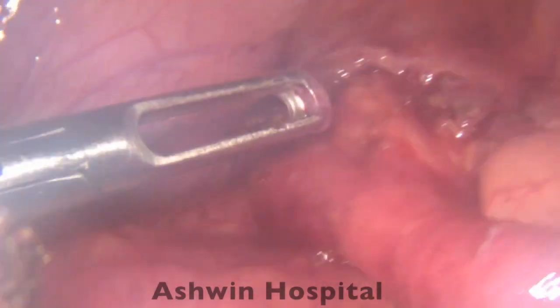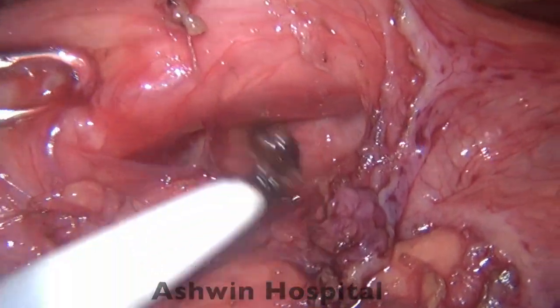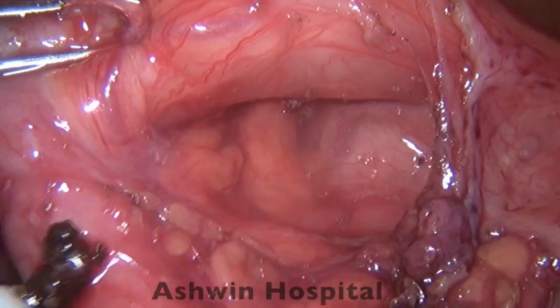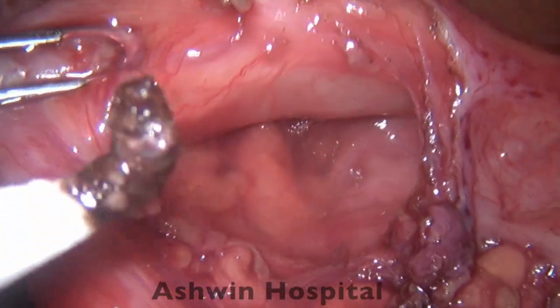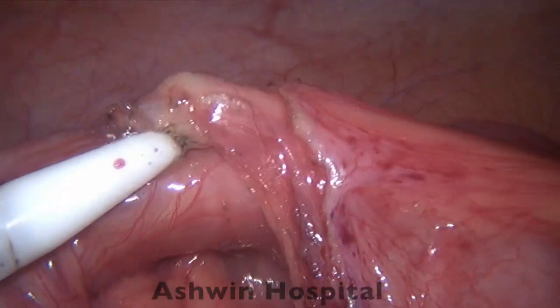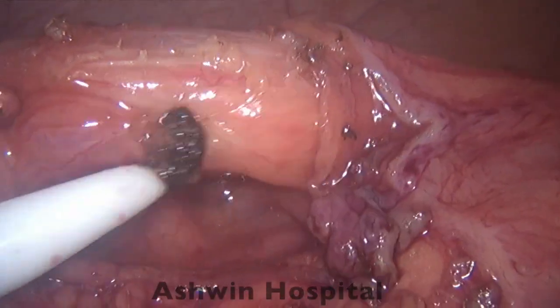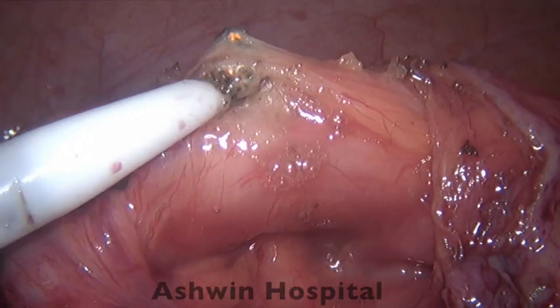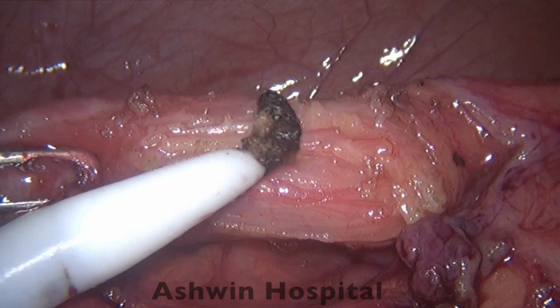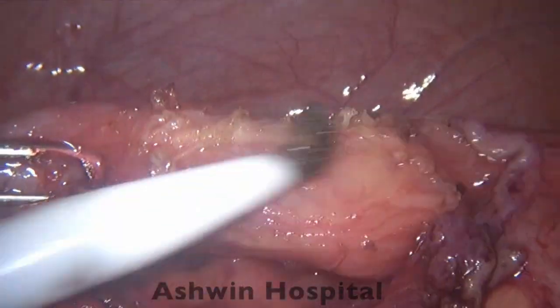Using short bursts of cautery, and with a little fogging, we clear the camera so vision is much better. With a combination of blunt and sharp dissection we identify the exact direction to keep dissecting. Working between the fascial attachments and the appendix, remaining attachments are taken down sharply using monopolar energy. Where there is fat with possible small vessels, we use cautery and sharp dissection rather than blunt fashion.